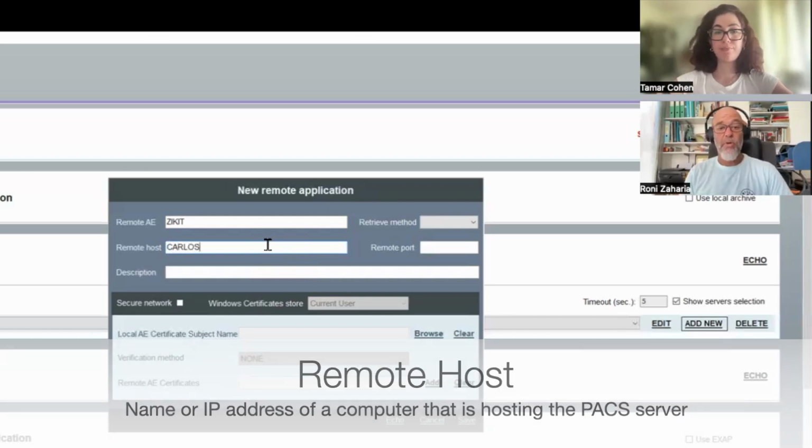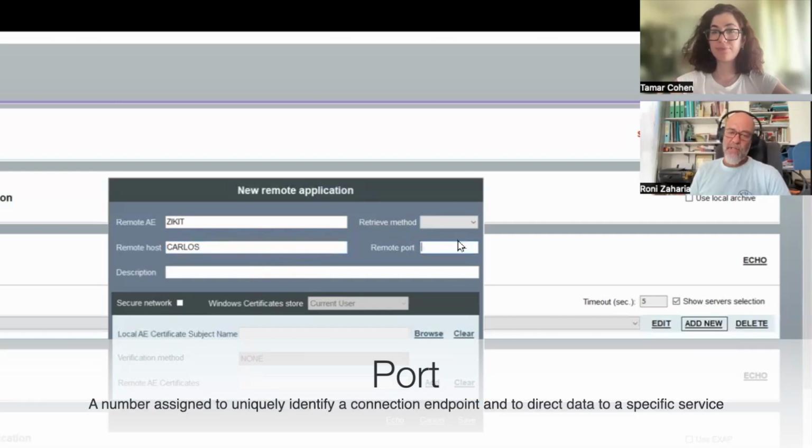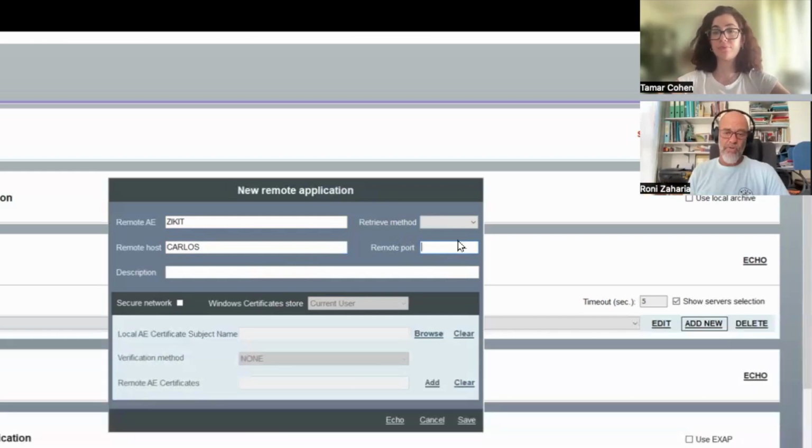And you also need the port. So what is a port? On a computer or a server, you can run many applications, and each one that uses the network or listens for incoming connections has its own port. When you call an application, you call its port. If it's a web server, it will probably listen on port 80. The standard port for DICOM is 104. Our PACS, Zikit, serves all the DICOM services on the same port, 104.